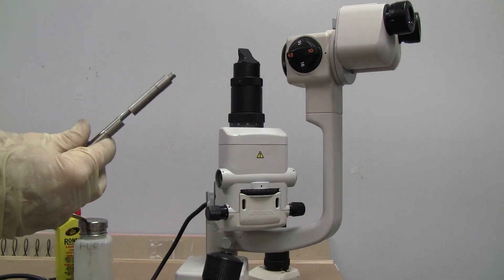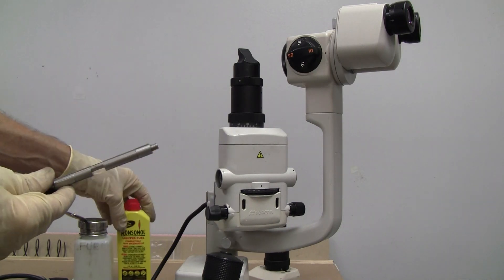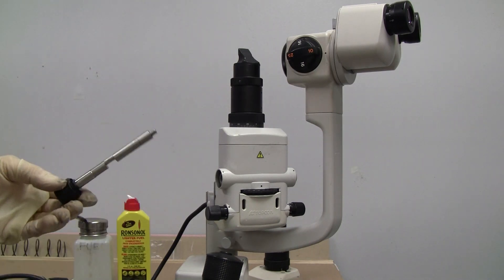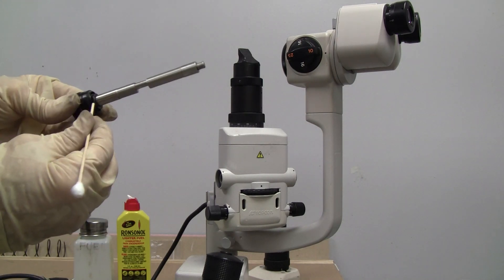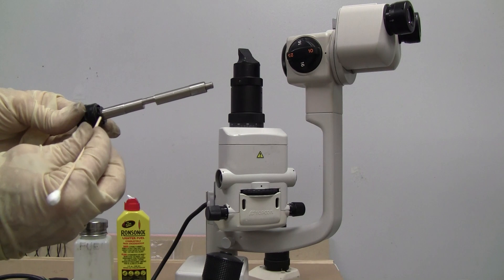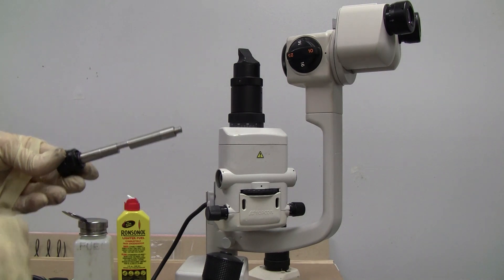Okay, I've cleaned the shaft with some fuel. And notice that there are three washers on this end. There's a flat washer, a wave washer, and another flat washer. Very thin.